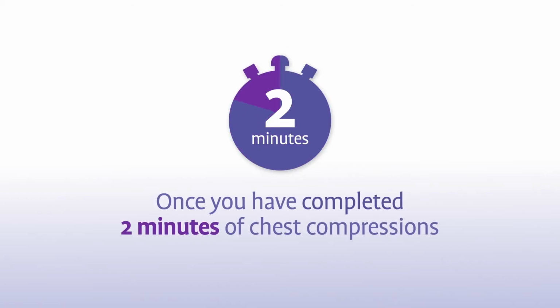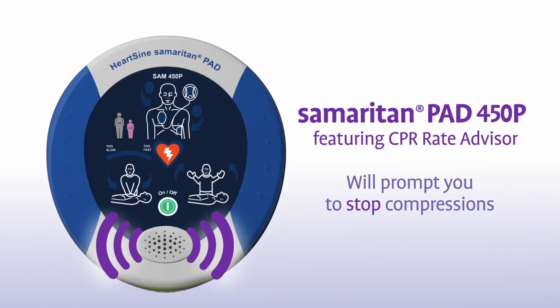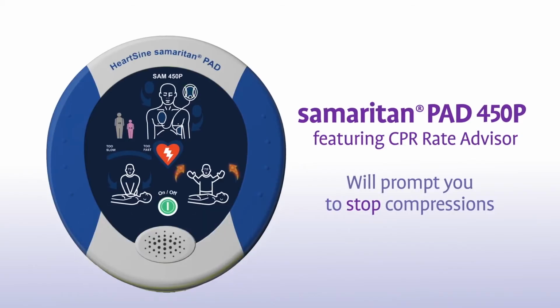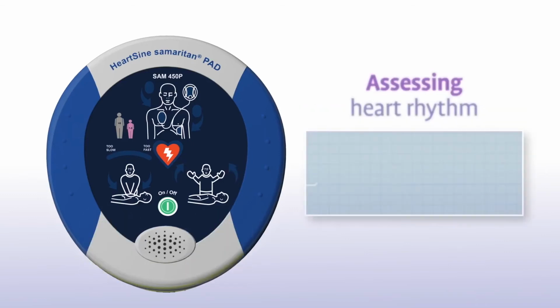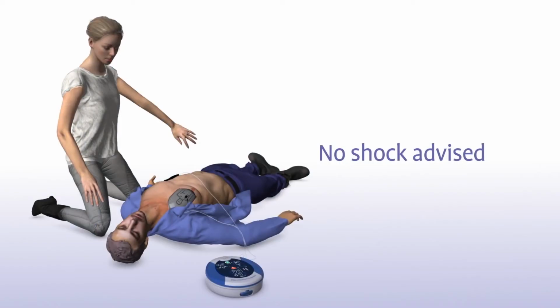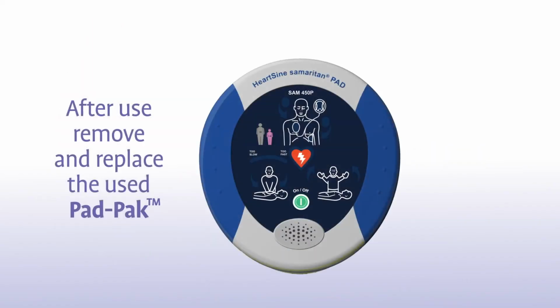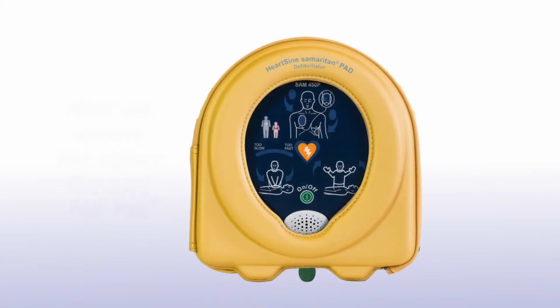Once you have completed 2 minutes of chest compressions, the SAM 450p will prompt you to stop chest compressions. Stop CPR. And again assess the patient's heart rhythm. Assessing heart rhythm. Do not touch the patient. Sometimes, no shock is needed in a life-saving situation. No shock advised. And the Samaritan PAD will tell you in that instance, or advise you to continue to perform CPR.